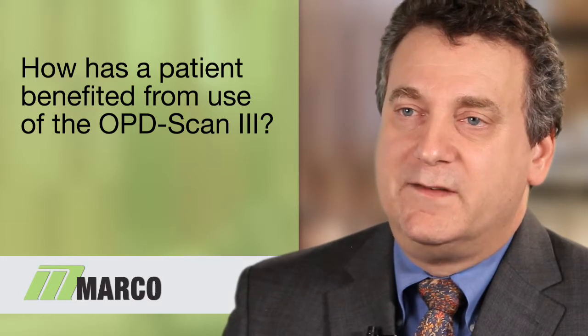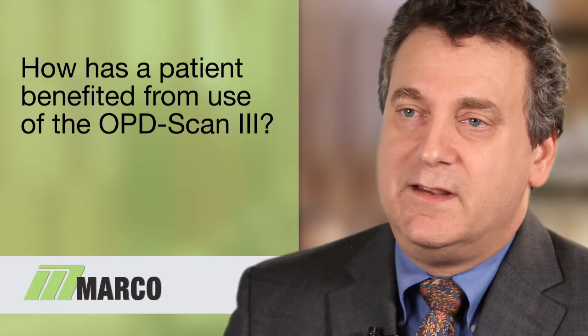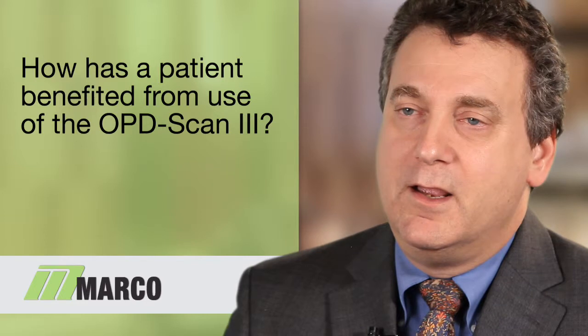With the NIDEK OPD scan and the ability to assess the internal higher order aberrations, we could see that almost all her aberrated vision was coming internally from her lens. Not only did that really allow us to clinch the diagnosis for her, but again, being able to show that objectively and graphically to a patient, it really helped her understand what was going on in terms of her vision and what her problems were, and as a result made the management of her reduced vision much simpler as well.